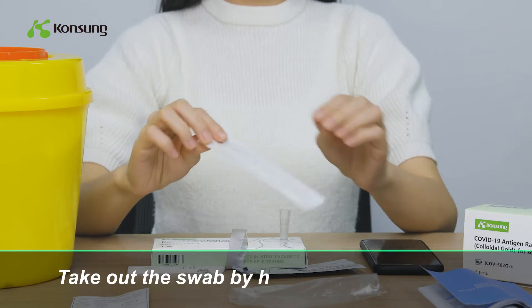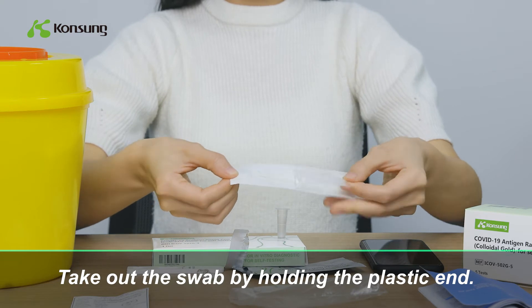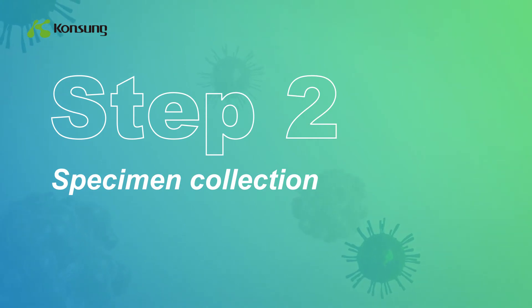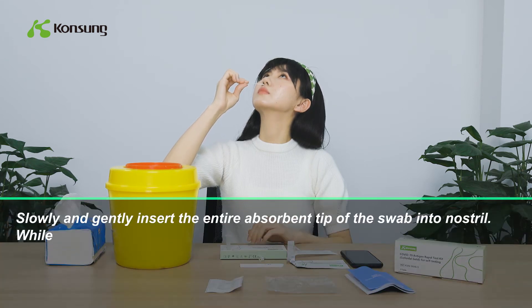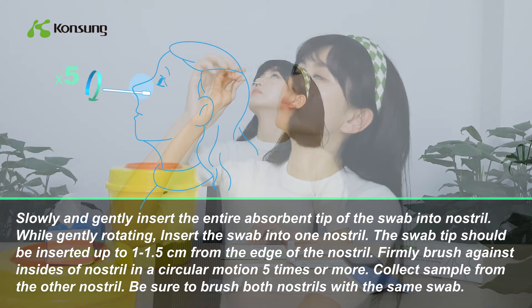Take out the swab by holding the plastic ends. Do not touch the tip of the swab. Slowly and gently insert the entire absorbent tip of the swab into the nostril. While gently rotating, insert the swab into one nostril.